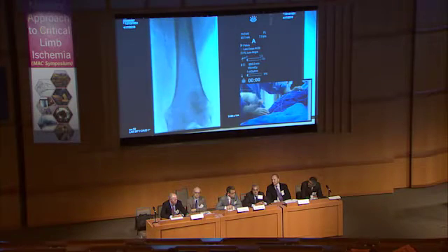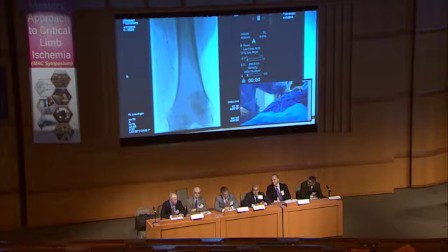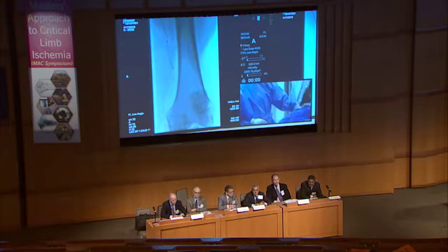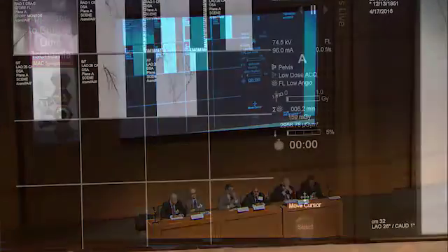So Bruce, your classification scheme, where does it fall? And what is your decision in terms of endovascular or doing some more imaging or surgical approaches in this case? Bruce, before you answer, can I show you some better pictures here? Sure. I think we have some nicer pictures.